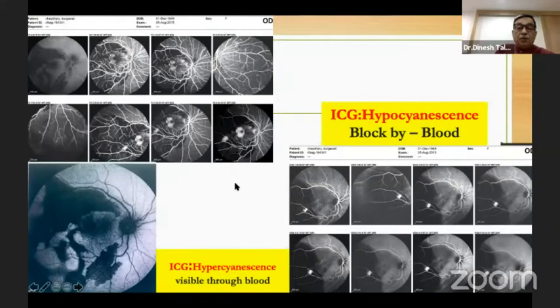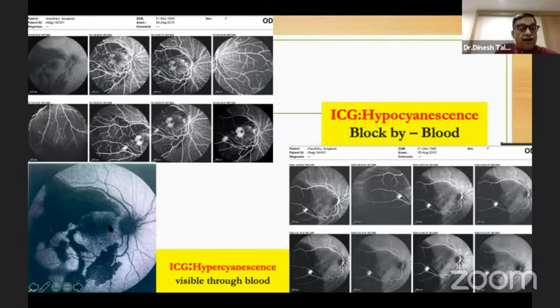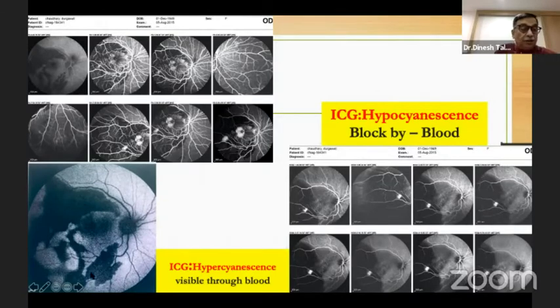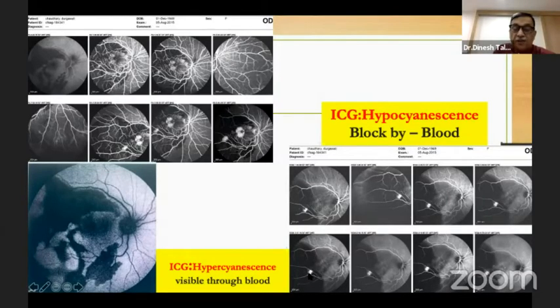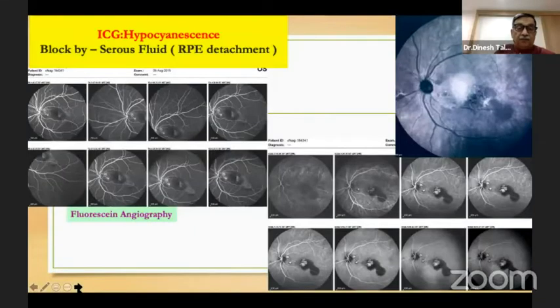To show you what hypercyanescence looks like — on one side you have the fluorescein angiogram, and below you have an infrared photograph. This shows a large amount of subretinal bleed, and you can see through this subretinal bleed the underlying hypercyanescence, and you can have a reasonably good picture of the underlying choroidal vasculature as well.